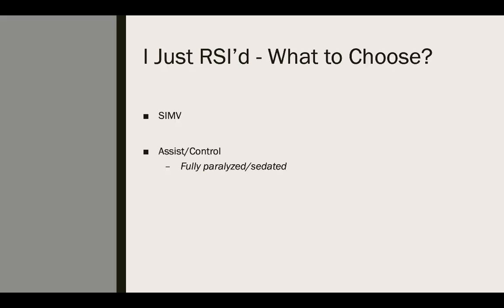Whew, but what if it's your choice? It's not an interfacility transport. You don't have a respiratory therapist right there. You just are beside this patient and you're putting them on a vent. What do you choose? Like I said, I'm just going to go with SIMV, just in case the patient starts breathing on their own.